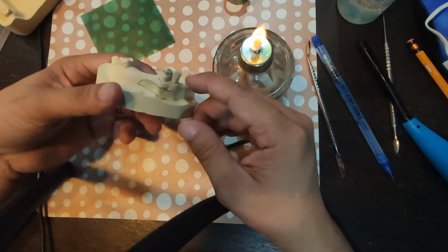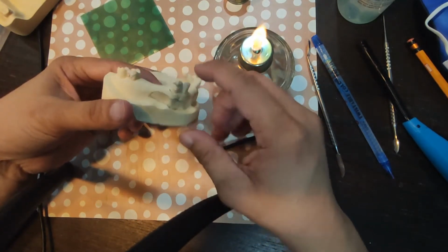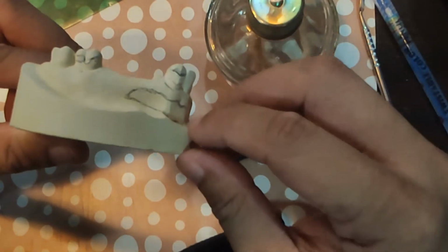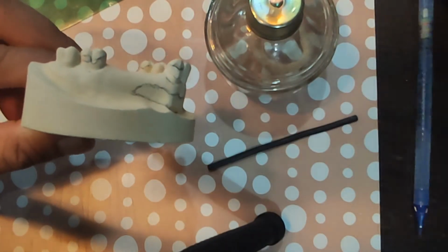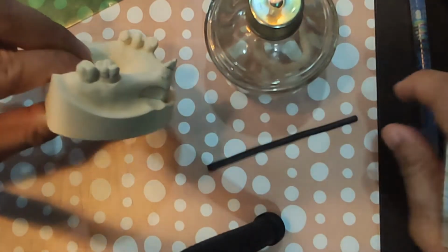So the first thing I want to do is to block out the tissue undercut here because I am going to use a gingivally approaching clasp. Right? So the approach arm is going to cross there, and for it to not engage the tissue undercut, kailangan naka-blockout siya.